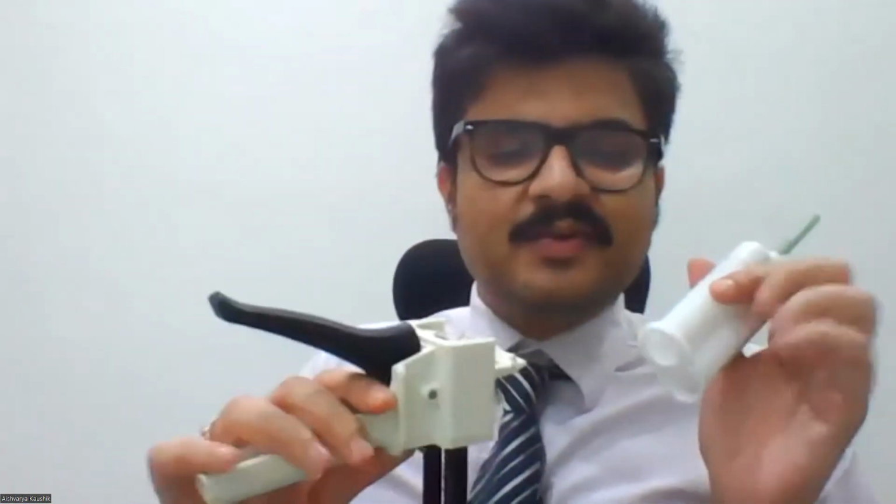So for this, let us first of all understand the apparatus or the instrumentarium that we use. So we have a gun, right? We have a plunger on this gun, number one. Let us just disassemble this and try to understand this. So this is basically the gun, which has a trigger. This is a trigger, and it has a plunger. So when I keep pulling the trigger, the plunger keeps moving forward.